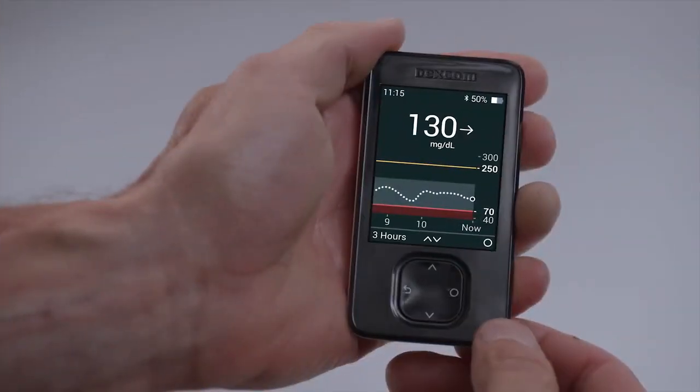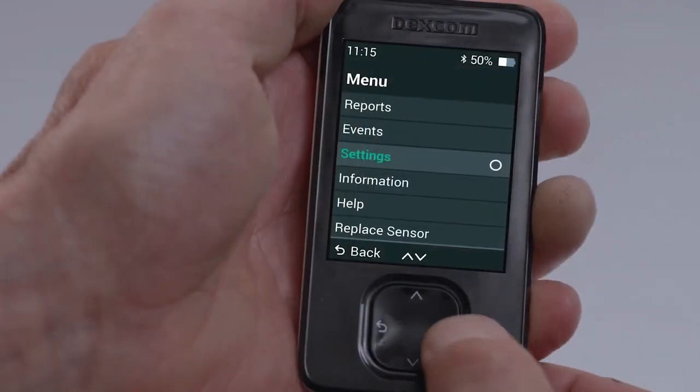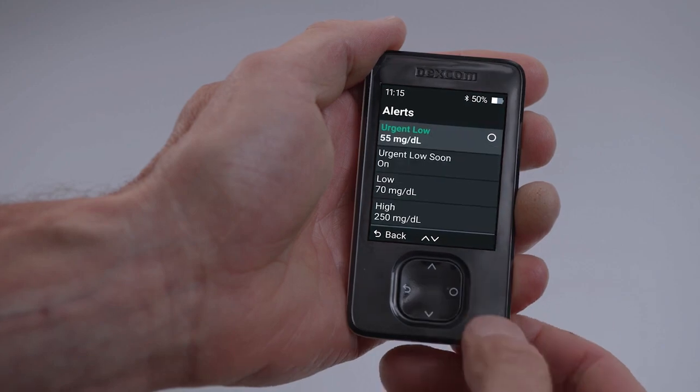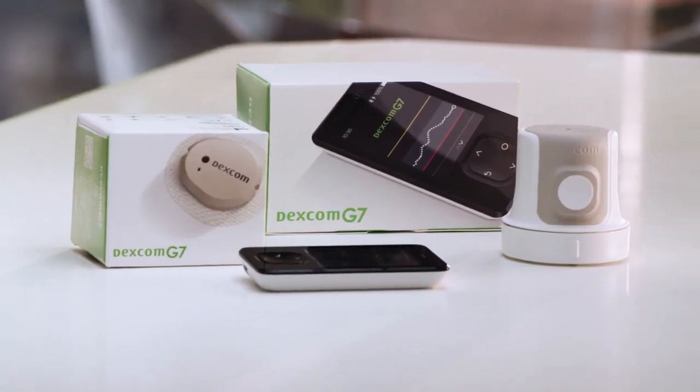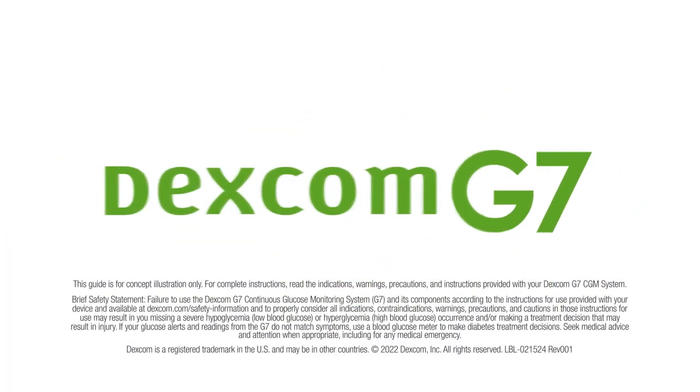The sensor warm-up timer lets you know when you'll start getting readings and alerts. After your warm-up, you will start getting readings and alerts. Remember, you can customize your alerts anytime under Menu, Settings, Alerts. That's it. You have successfully set up your Dexcom G7 receiver.